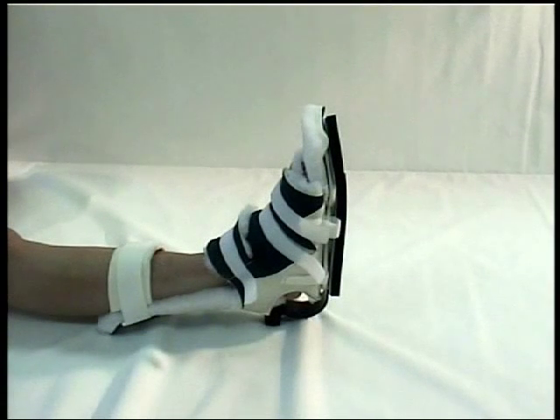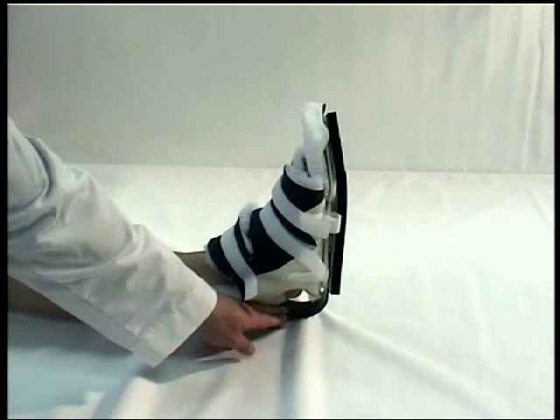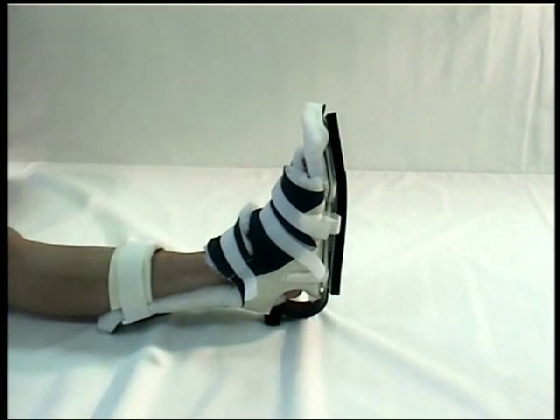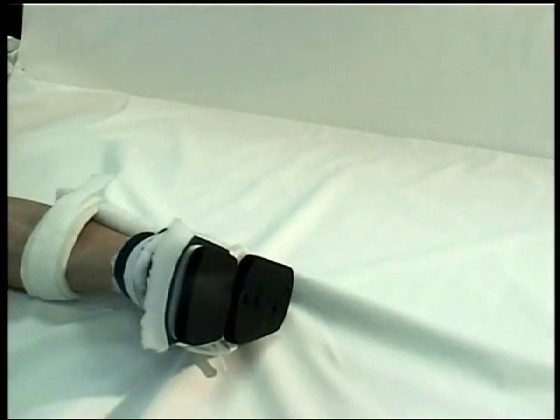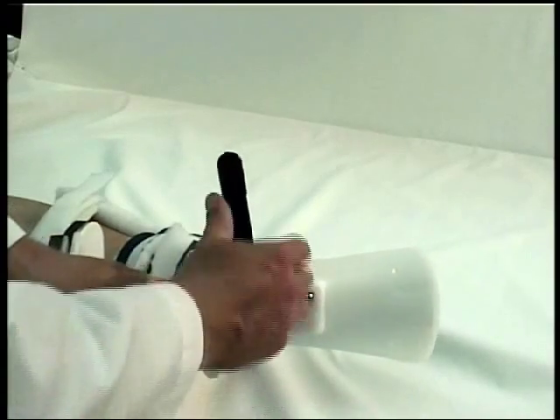Once completed, have the patient fully extend their leg and evaluate positioning and any rotational anomalies. If unwanted internal or external rotation exists, pivot the posterior rotation bar accordingly to offset this rotation.